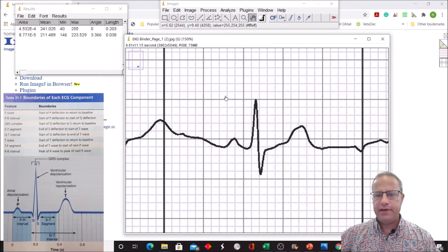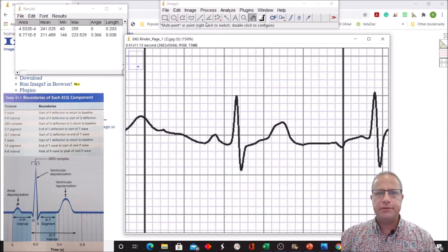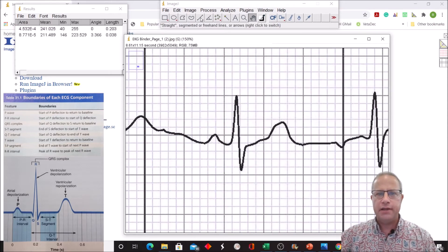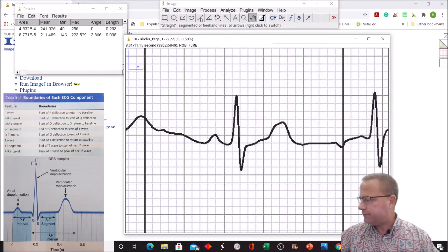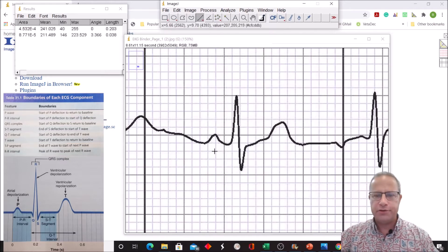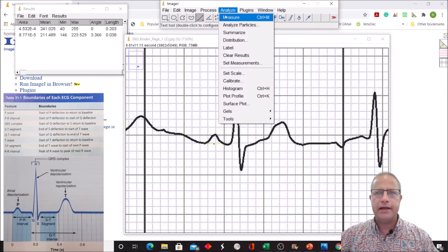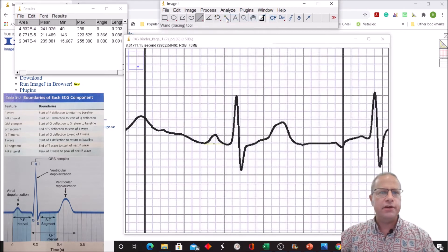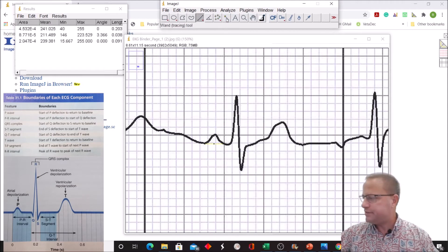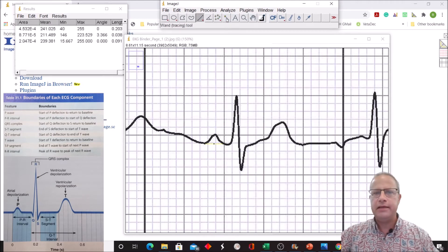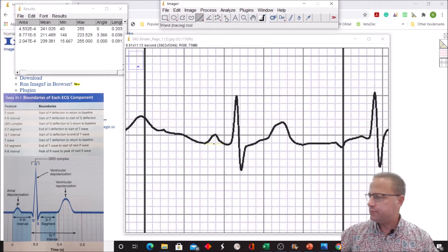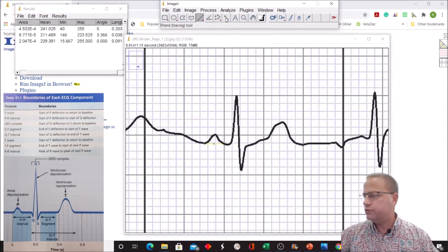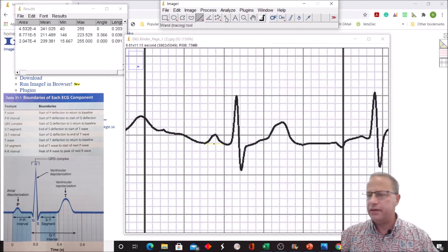The P-wave represents atrial depolarization. I look at the definition for P-wave, and it's the start of P-deflection to return to baseline, so somewhere about here to about here. We analyze, measure, and get 0.091. We see that the average duration ranges between 0.07 and 0.18, so that's fine. That's our P-wave.